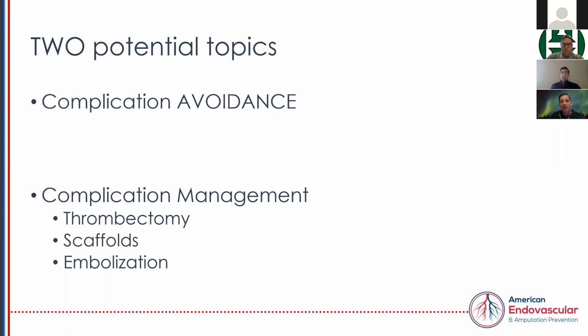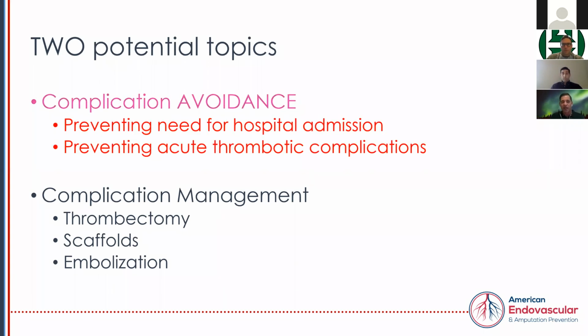And today, in talking about avoiding complications, there are sort of two things. One is the avoidance, and the other is the complication management. And we're not going to focus on the management today, because clearly in the course of everything we all do as healthcare professionals, we'll occasionally have some difficulties and challenges that we need to figure out and work our way through. But we're going to focus today on the avoidance part. And for us, the avoidance part is really two big things. One is we're working in an outpatient environment, so we don't want to do anything that would result in clinical deterioration on the table or in the facility that leaves patients needing a hospital admission.